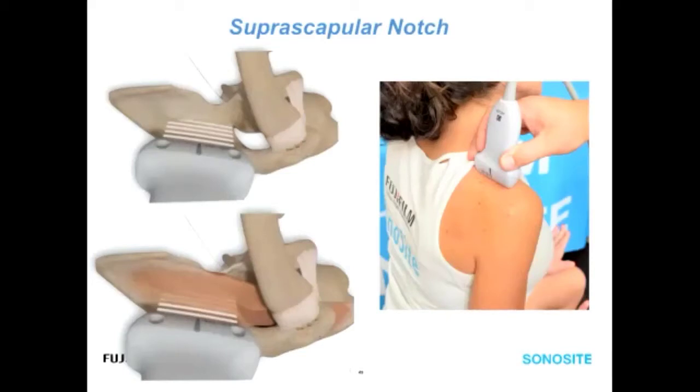And my tip, and we'll show this tip while we scan, is to look at the posterior edge of the probe on the anterior edge of the spinous. Sorry, I'm going to back up again, of the scapular spine.